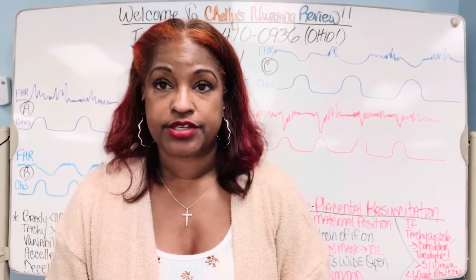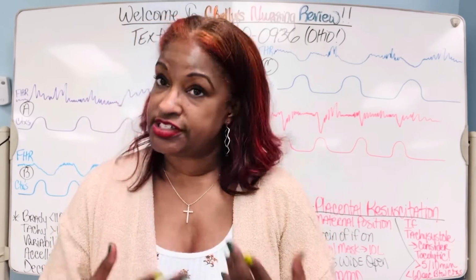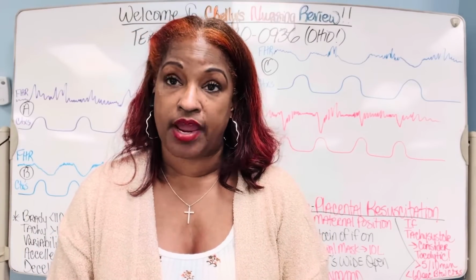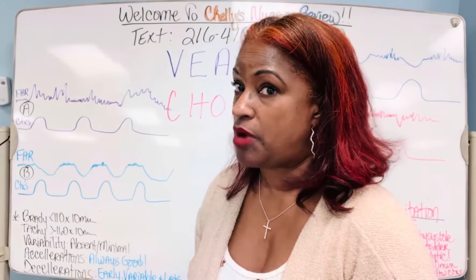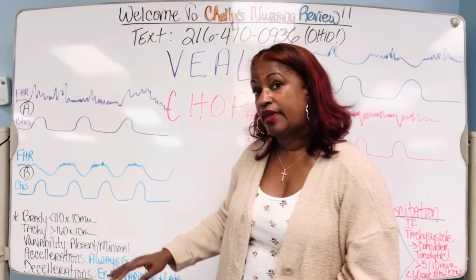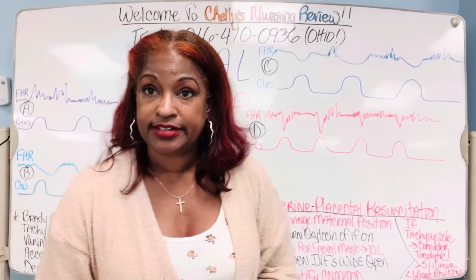So she is now approaching the hospital in labor. But right away, as soon as the nurse puts the external fetal monitor on the patient and the toco, she's definitely having contractions, and she's absolutely showing some changes in the heart rate that are reflective of what I said. So which one of these monitor strips are her? Is she strip number A? Is she strip number B? Or is she strip letter C or strip letter D?